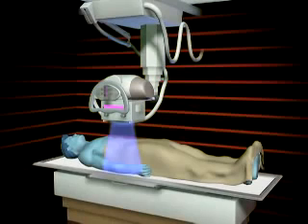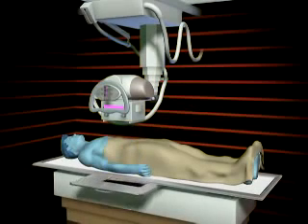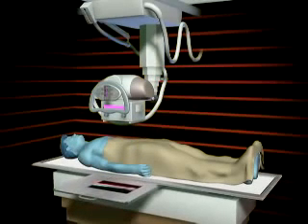As the X-ray energy passes through the patient's body, the photons of the beam reach the film and cause a chemical reaction.